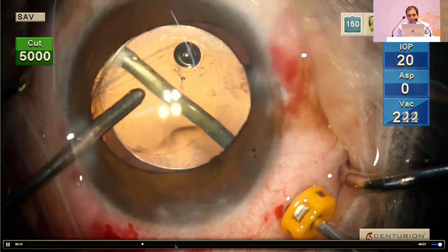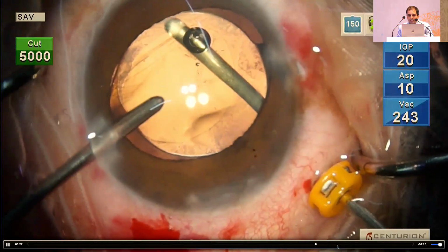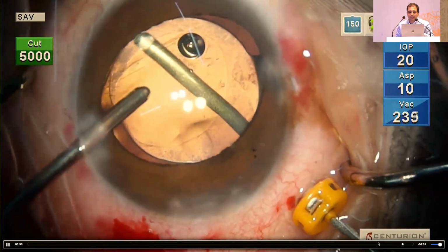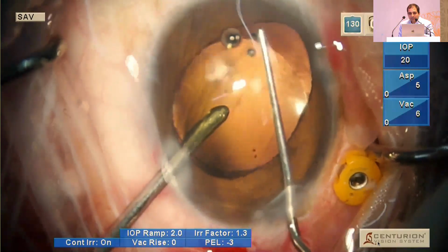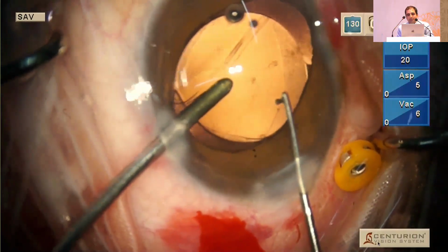So going ahead in the area of the PCR and around the PCR and doing an adequate vitrectomy. And once that is done, to improve the stability, I'm thinking what can I do to make sure that this IOL doesn't move or dislocate with time. So I'm going ahead with what I've learned actually from Dr. Priya Narang, with whom she published reverse optic capture.